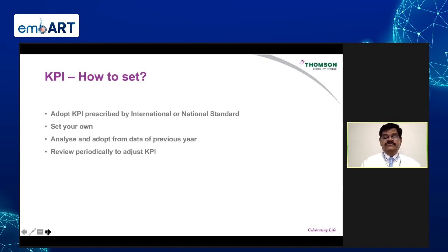So for example, last year, if you achieved, say, a 70% fertilization rate for ICSI, then you review and make that 70% your target to reach this year. And if you reach below 70%, you need to question why it is happening. This review should be done with important people, such as management and your medical director, or whoever is responsible for the center. That's going to explain to you why these KPIs are helpful to you.